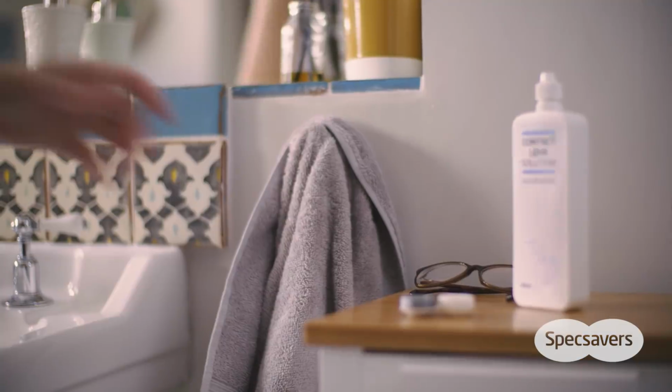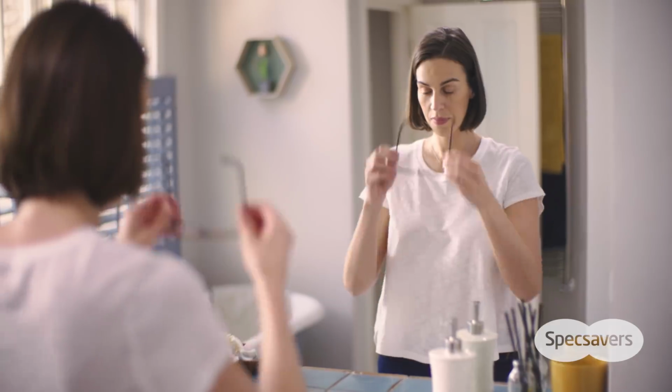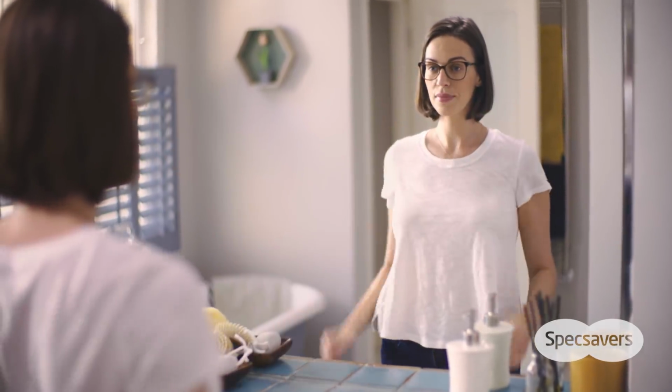If you're storing them for a long period of time, you should change the solution at least once every 3 days. And that's it, you're all done.